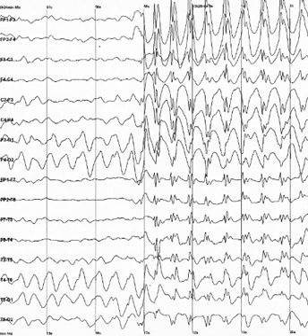EEG recordings do not directly capture axonal action potentials. An action potential can be accurately represented as a current quadrupole, meaning that the resulting field decreases more rapidly than the ones produced by the current dipole of postsynaptic potentials. In addition, since EEGs represent averages of thousands of neurons, a large population of cells in synchronous activity is necessary to cause a significant deflection on the recordings.